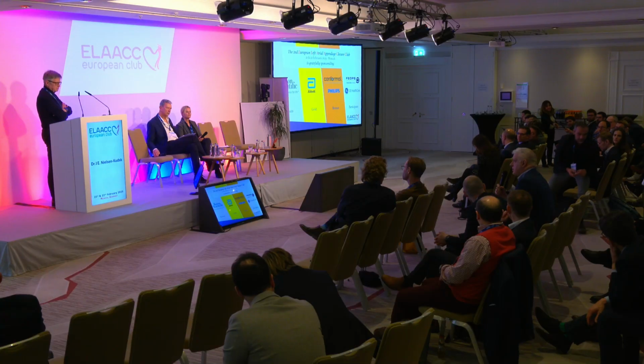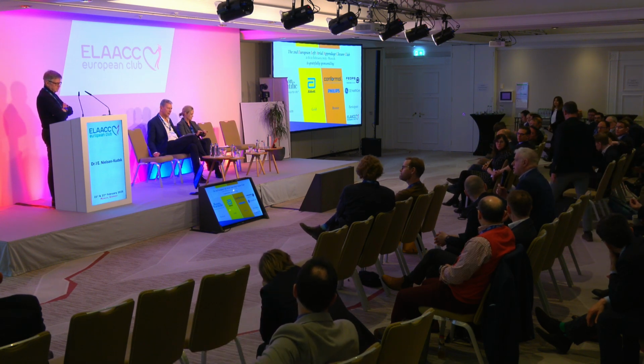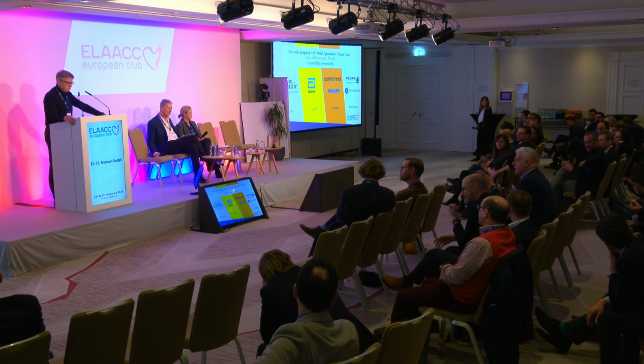Okay, the last question. We use ICE sometimes, as Sergio taught us, and in my experience, we cannot see properly the depth of the appendage. Therefore, in order to answer one of your questions, for me, the pre-planning is mandatory because of that. I totally agree, especially with 2D, but the question is if we now with 3D can skip pre-planning in some cases. I suppose that the sentence of Jens Erik, 'it can replace, with the question mark', was a provocative question, I suppose. Yeah.